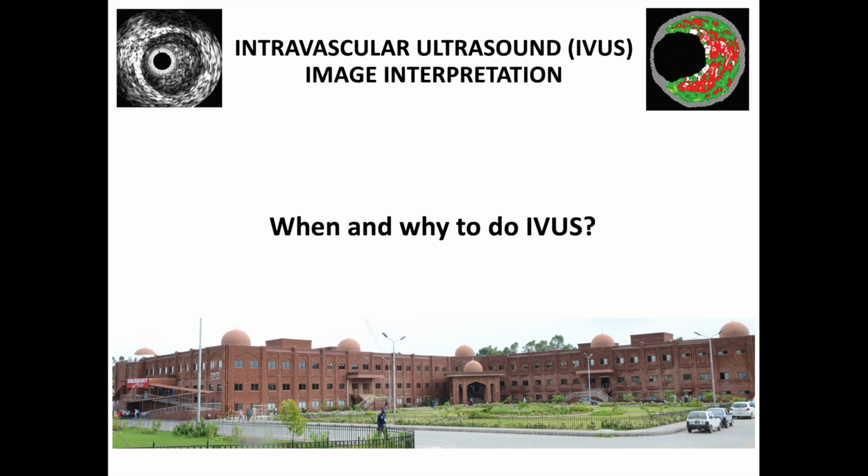This is the first talk of this series, when and why to do IVUS. What's the clinical evidence that we have for using IVUS? So let's start off with a case.